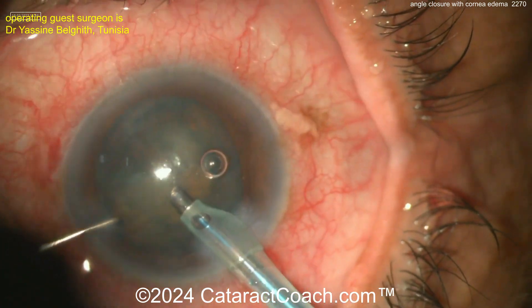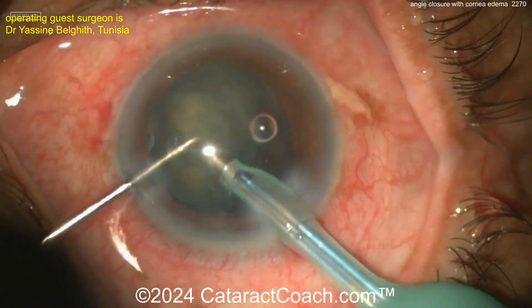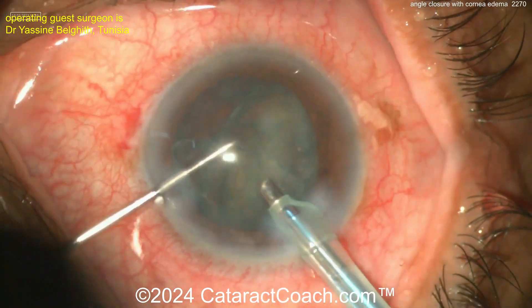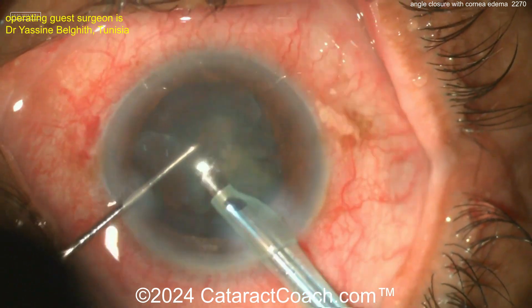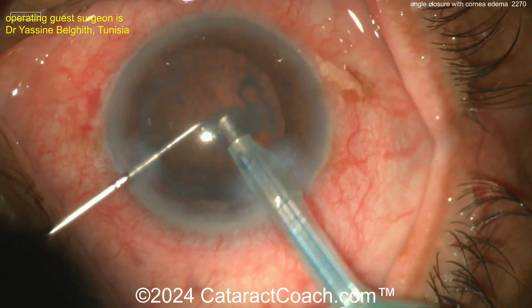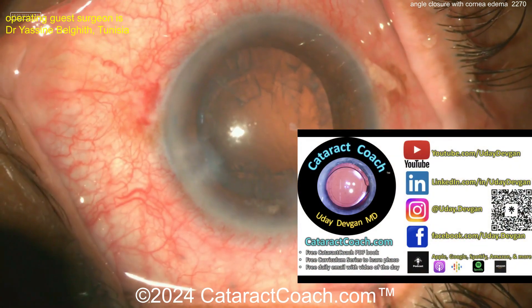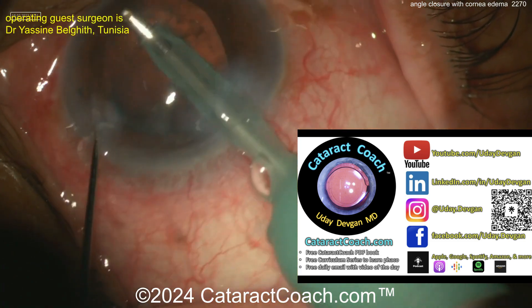As we get this cataract out, you're going to deepen the AC and that's going to solve the issues. I'm a big fan of this approach, especially for a cataractous patient over the age of 60. That 75-year-old coming into your clinic with 20/40 cataracts and a really shallow anterior chamber — don't do a YAG laser peripheral iridotomy, make them pseudophakic.